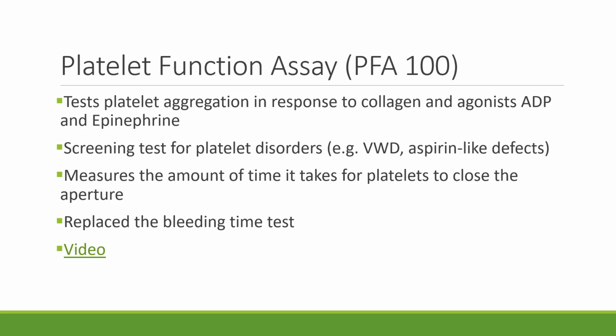and there are a few others that we're going to talk about, but overall we don't really get too much information about the platelet function other than it's abnormal versus normal. And it may be normal in response to one agonist and abnormal in response to the other, but if it is abnormal in either regard, we still consider it to be abnormal and further testing might be ordered.